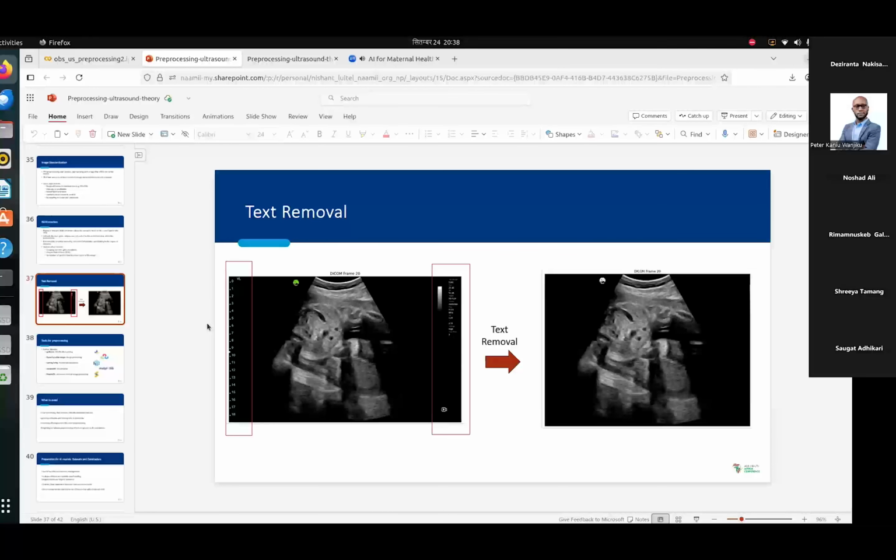Other times it is not perfect. What you can do is find a mask for some of the ultrasound images, and train an additional AI model that segments only the ultrasound fan, and you could remove all the text or things that are beyond it.